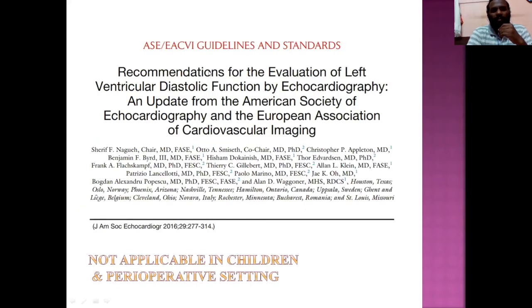So the next few slides will be based on this recommendation published in 2016 regarding the assessment of LA filling pressures. These recommendations are not applicable in the perioperative period and in children. It is always a good practice to do a preliminary cardiac examination to assess the LV dimensions, the systolic function, and also know the diastolic dysfunction before going into assessing the LA pressures.